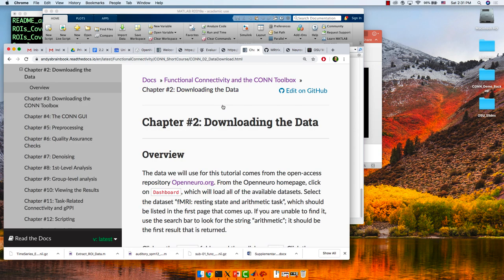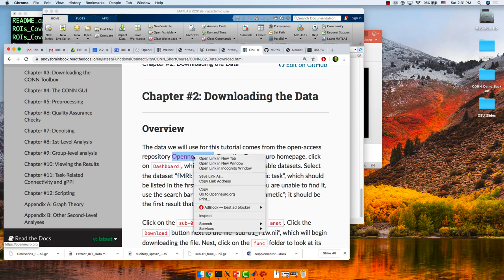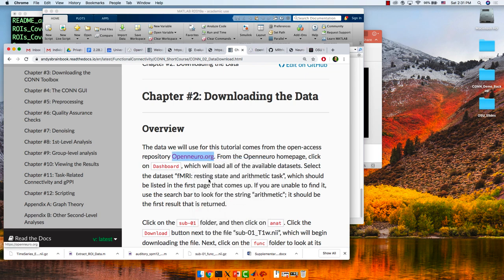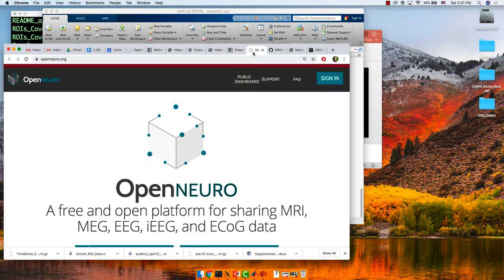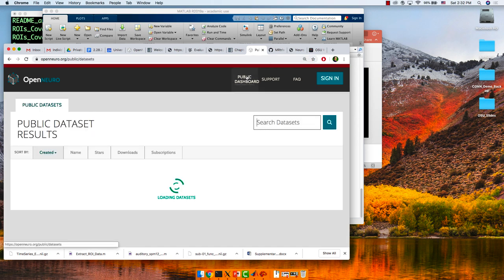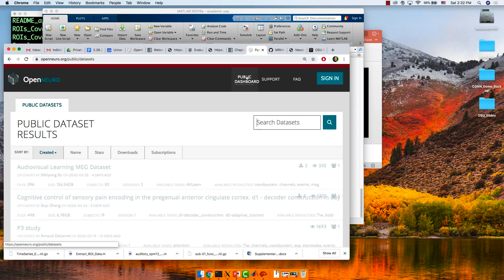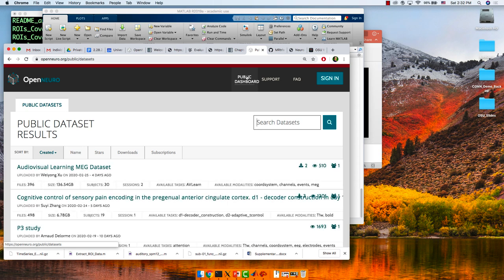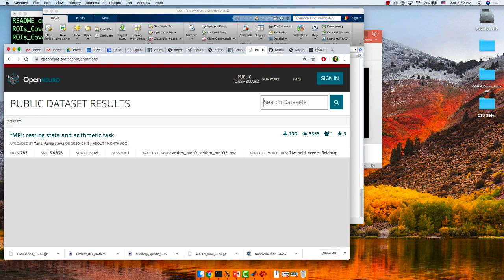Some people had an issue downloading the complete dataset — that's okay. I've had problems with individual datasets from OpenNeuro from time to time. Right-click on the link to open it in a new tab so you have both the OpenNeuro tab and the Brain Book tab open. Click on Public Dashboard, which lists all the different datasets — all in BIDS format. In the search toolbar, type 'arithmetic' and it should be the first result that comes up.